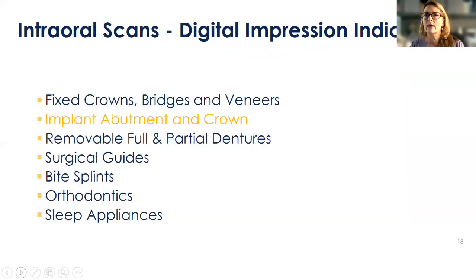Great. Okay, so we have covered in our previous sessions fixed crowns, bridges, and veneers. In future sessions, we're going to cover partials and dentures, and we can get into different full arch scans for surgical guides, bite splints, sleep appliances, and so forth in the future or on a one-on-one. But today we're going to talk specifically about implants.